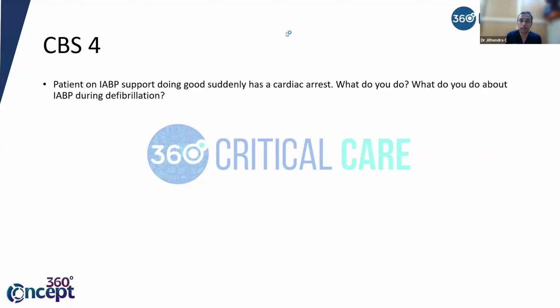So what about the IABP during defibrillation? Should I stop the IABP and defibrillate, or go ahead with defibrillation, or change the current, change the position? Continue defibrillation, go ahead. So yes, that's the right answer. Go ahead with defibrillation. No need to do anything with the IABP. Leave it like that, and you can go ahead with the regular defibrillation. Absolutely right.